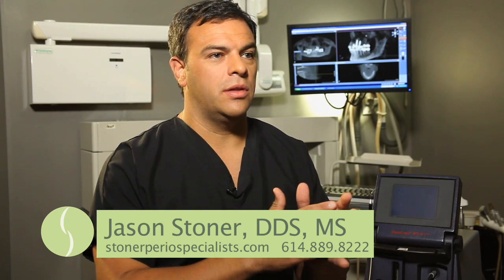Then we can do a cleaning of the root, and we come back with a laser in a second phase, all in the same appointment, where we create a blood clot between the gum and the tooth, the gum that is now eradicated from the diseased tissue and bacteria.